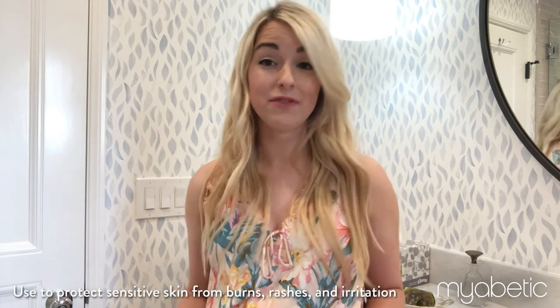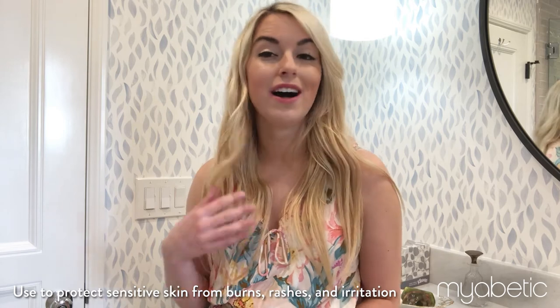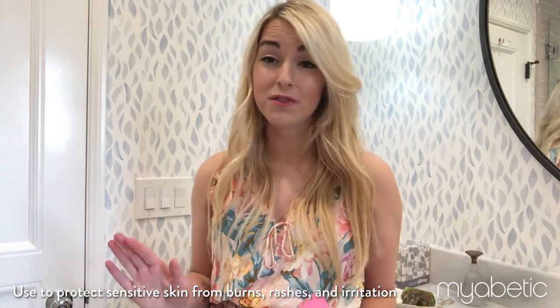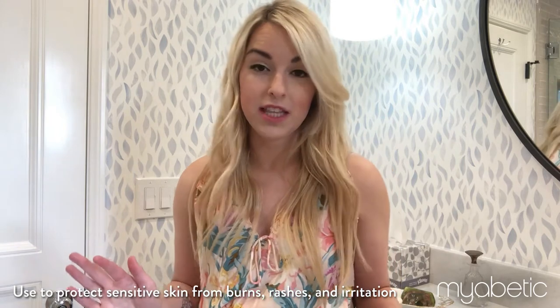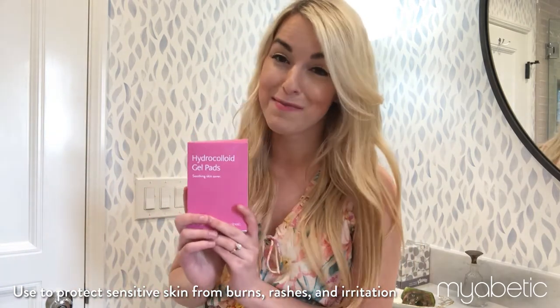Hi, I'm Maggie. I've been living with diabetes since 2002, and these are hydrocolloid gel pads available on myabetic.com. I've been getting some really terrible burns from my diabetes devices — from all different ones. As people with diabetes, we're constantly putting on new devices, and these burns are extremely painful and uncomfortable. I am done dealing with them, and that is why myabetic has created these hydrocolloid gel pads.